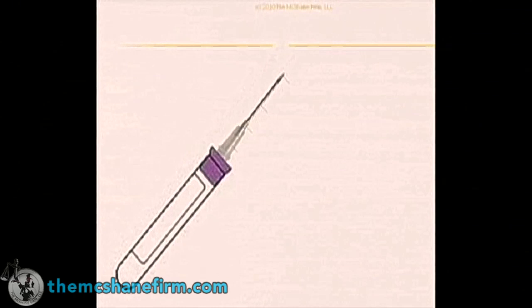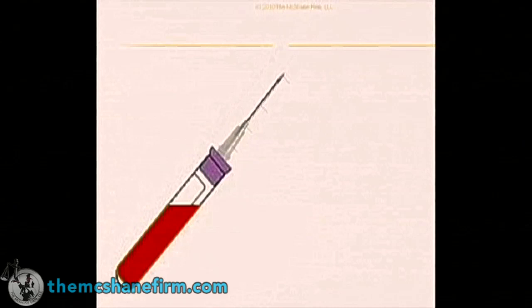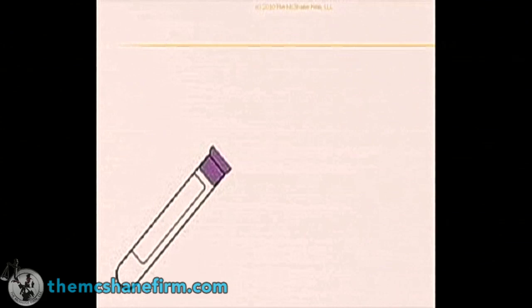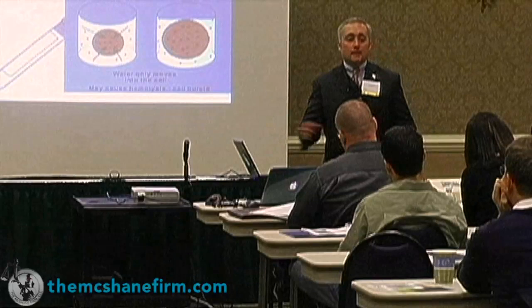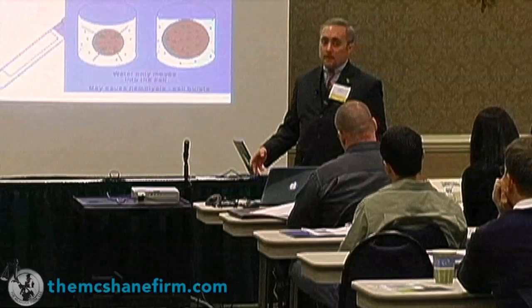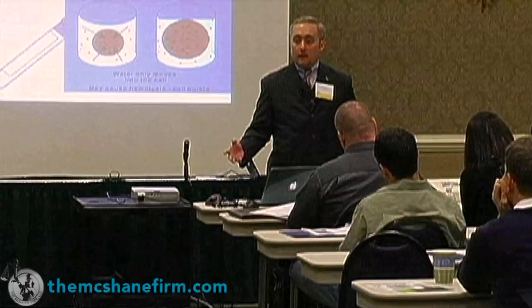The reason why that is important is the tube and the way it fills. You put on the normal needle, and it fills up nice and gently, just like that. That's the way you want it, because you don't want to rupture the red blood cells contained within it. If you have the butterfly needle, it comes jetting in very quickly, just like our thumb example. And that can lead to what's called hemolysis. Hemolysis is red blood cell rupturing, especially in enzymatic assay testing. Hospital blood testing spells disaster, because you're releasing the red blood cell and its parts, and it can over-report someone's blood alcohol content just because the nice phlebotomist thought they were doing a favor and providing comfort. We see that happen a lot where we are.